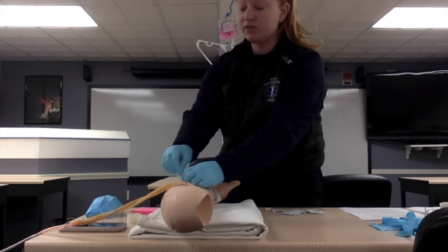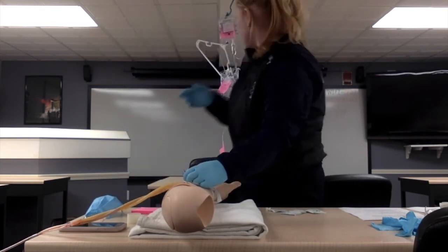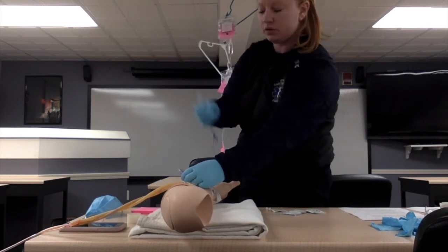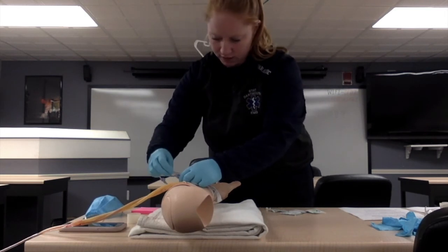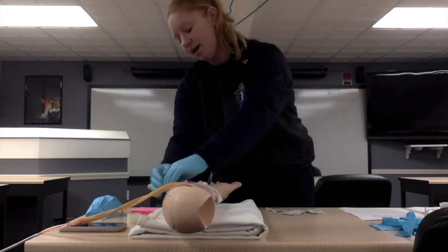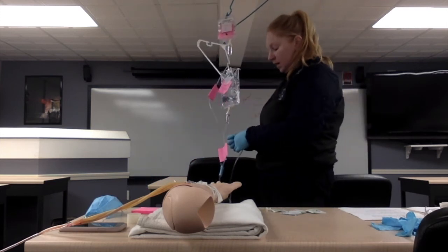We're going to clean this for at least 15 seconds with this alcohol. We're going to make sure that it air dries. We're not going to fan it or anything like that. Once it is dry, we're going to take our infusion line. This cover's still on it, so it's still sterile now that this is dry and cleaned. We're going to thread these together to confirm, so that's all set. Secure that line. And now at this point, that's already open. We already have this infusion going, but now we can open up this.